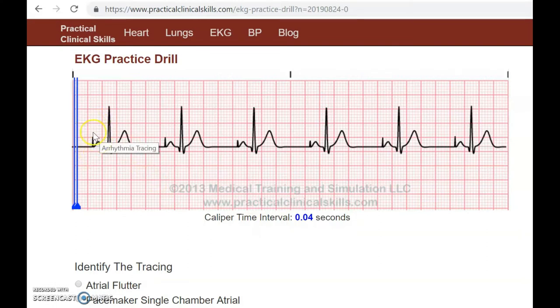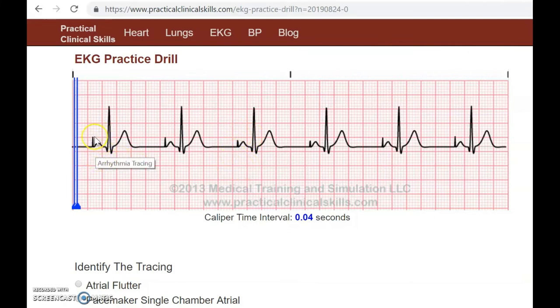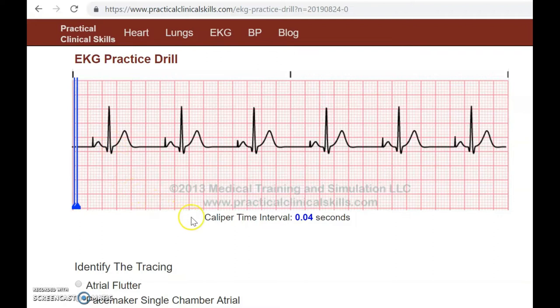This one we're looking at has the spikes popping up in front of our P wave, so here they're all popping up in front of the P waves. That should tell you this is an atrial pacemaker. When we refer to the P wave we're referring to the atrium of the heart. If the spike popped up in front of the QRS complex we'd call it a ventricular pacemaker, and if it pops up in front of both the P and the QRS we call that an AV — atrial ventricular — pacemaker. So this one is an atrial pacemaker since it's in front of the P wave.